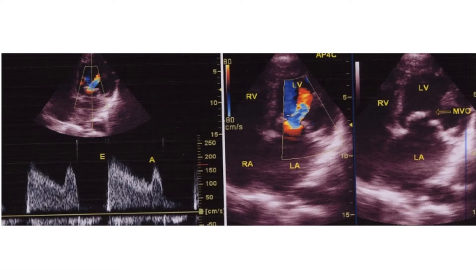Mitral valve area can be estimated from the downward slope of the E wave. The slope becomes more flat as the severity of mitral stenosis increases. The pressure half-time (PHT) of the descent of the E wave is calculated by the computerized algorithm in the echocardiograph. PHT is the time taken for the peak pressure gradient to fall by half, or the velocity to fall by a factor of root 2.